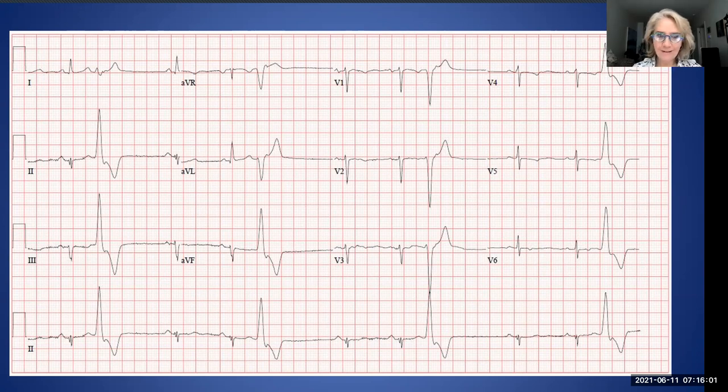Okay, well, I'm not exactly batting. Okay, for this one, I had question marks for the rate. I had put 38 and also 75. I don't understand why. I did this over a week ago, so I'm not sure why I had two. And I put that it was bradycardia. Okay, fine.